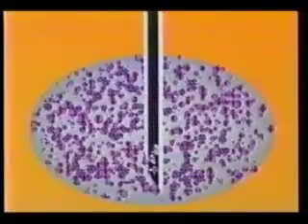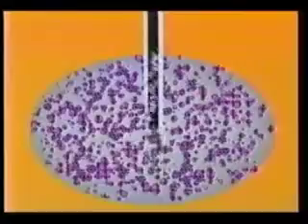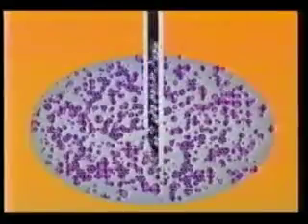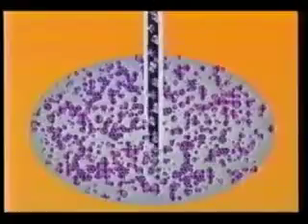In order to extract sufficient amounts of material, it is necessary to move the needle back and forth through the tissue. The tip of the needle will then dislodge small fragments of tissue, which will collect inside the needle. Applying suction helps in collecting and transporting tissue fragments up through the needle.